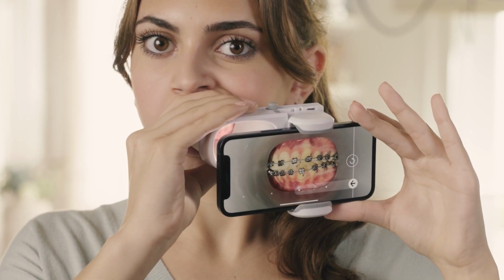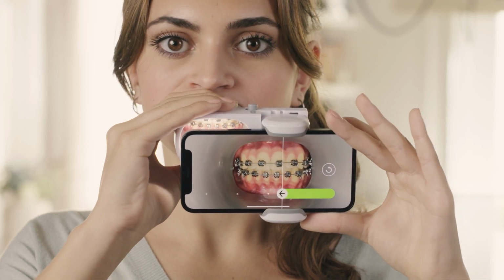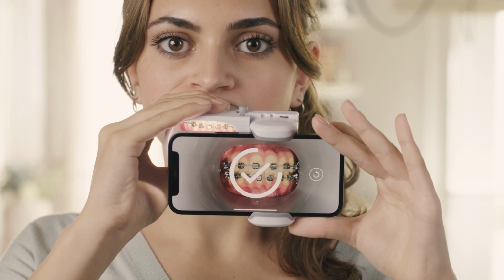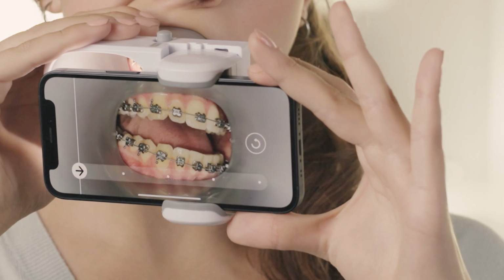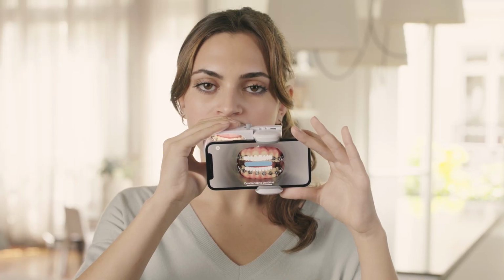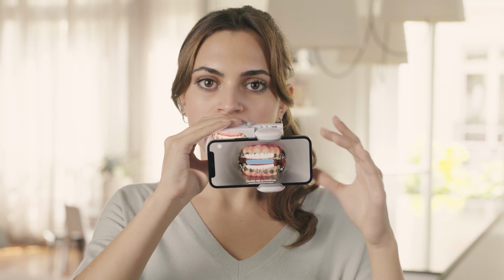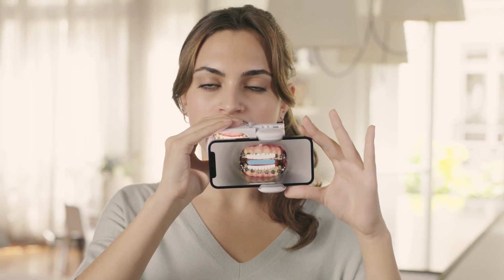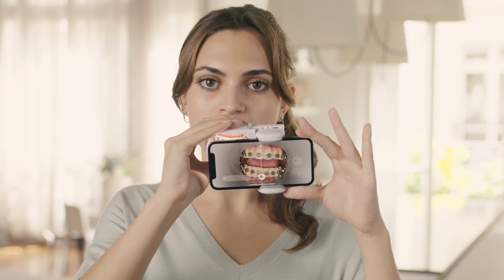Back to the center. Make sure you move the scan box at the same rate as the progress bar. If you need to restart the current step, simply press the Restart button. For this next step, you'll have to keep your teeth slightly apart and scan side to side. Double tap to continue. Open your mouth just enough for your tongue to fit in between your teeth.